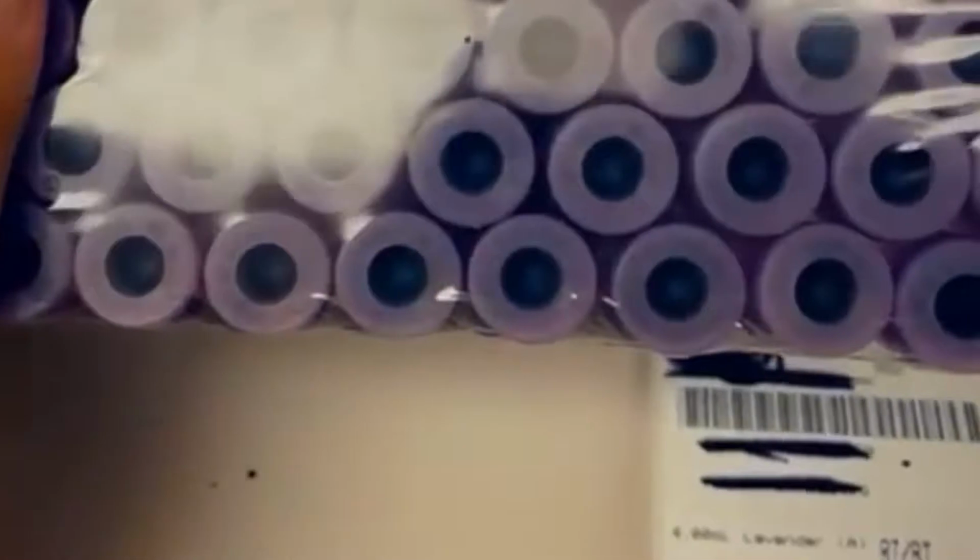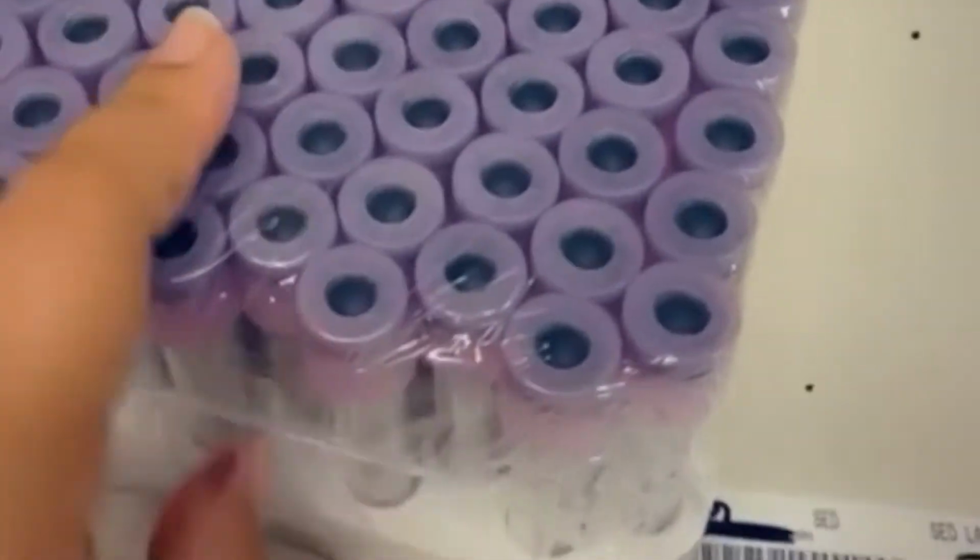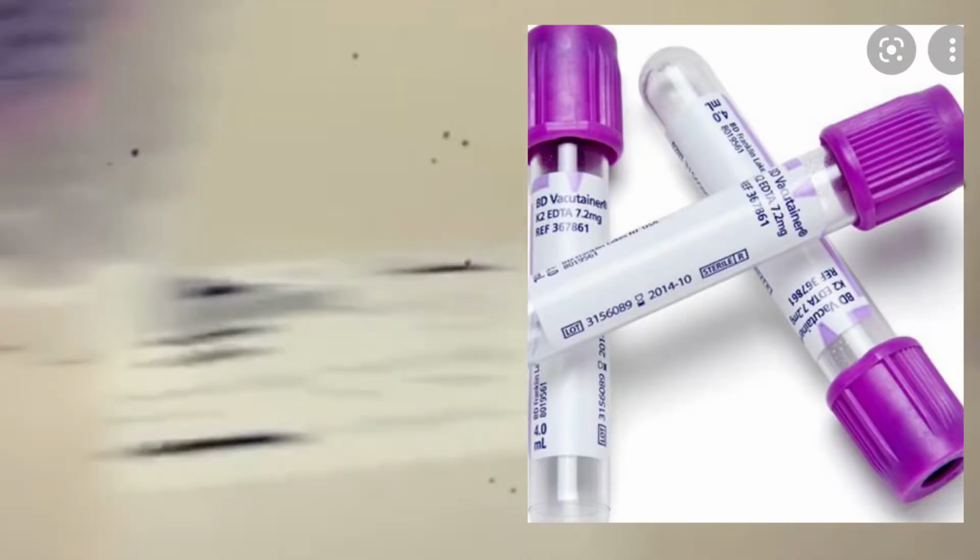CBC is a hematology testing, and as you can see right here, it'll tell you that this test goes on a lavender tube. Now, lavender tube comes in different shades, but they all go in a tube that goes like this, or it can go in a tube that's darker colored, darker purple.